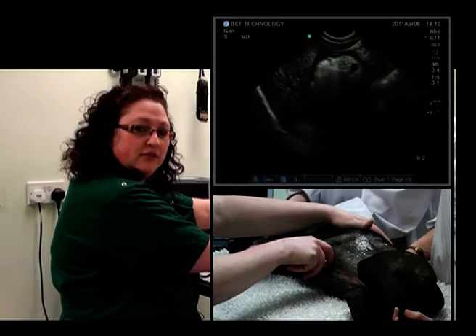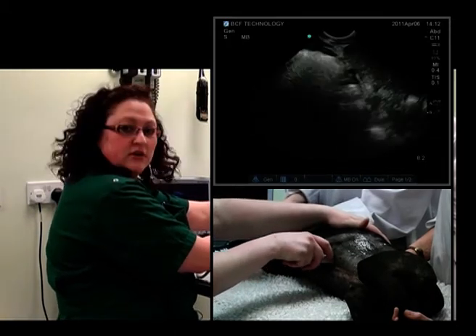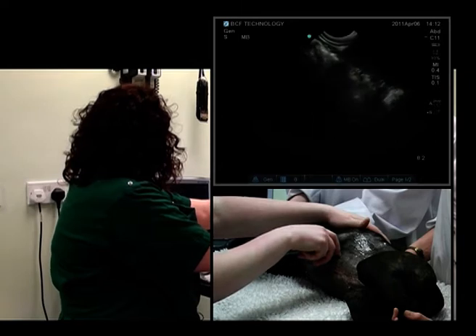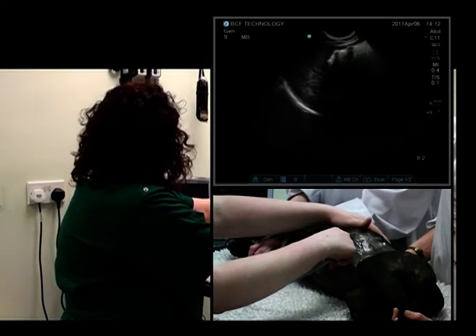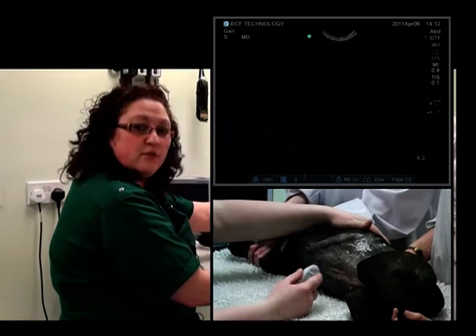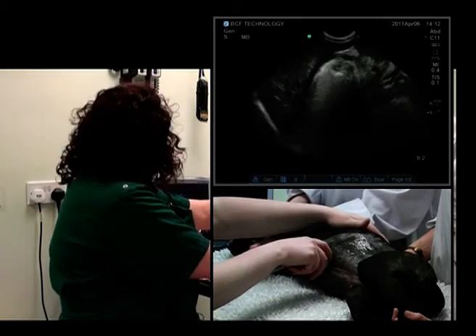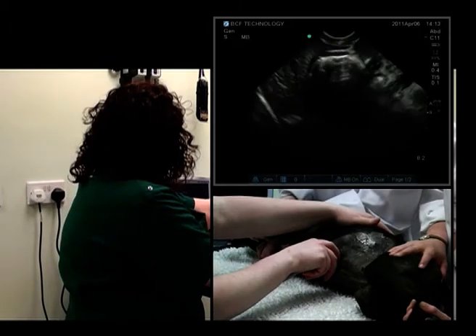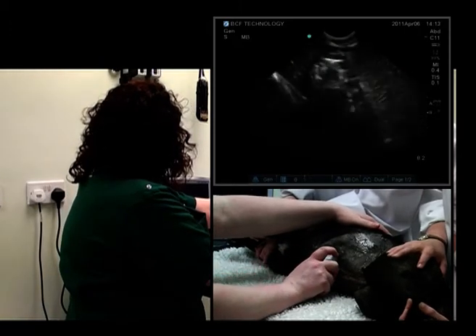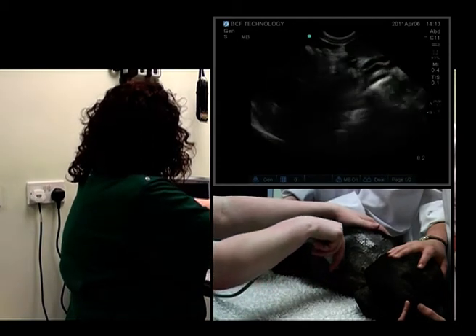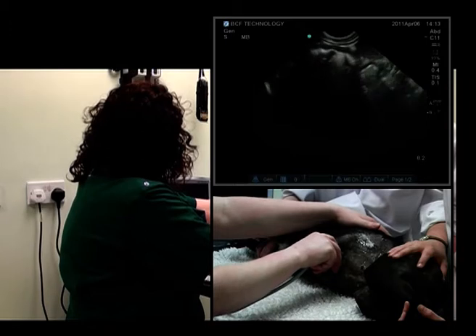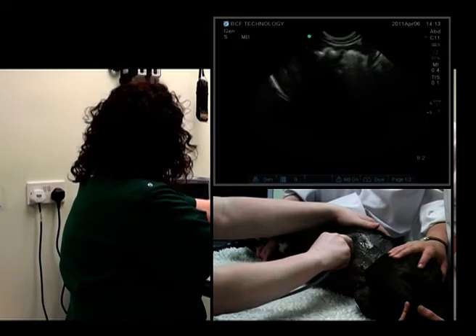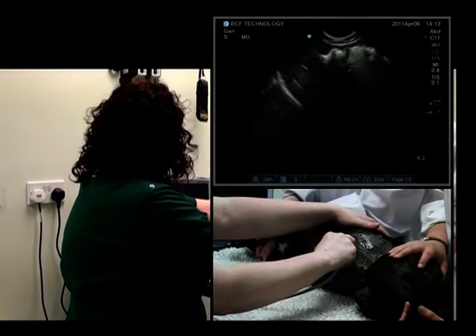We'll start again at the level of the xiphisternum and rock caudally to see the pylorus, and cranially to see the fundus. We'll do that one more time: start at the level of the xiphisternum, just caudally to the liver, fan up and down through the pylorus, back to the middle, rock caudally for the pylorus, and cranially for the fundus. Now we've seen the stomach.